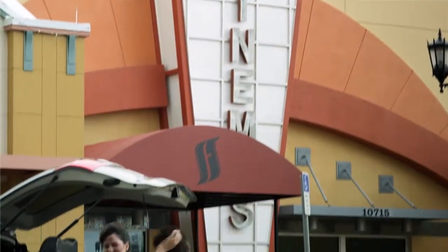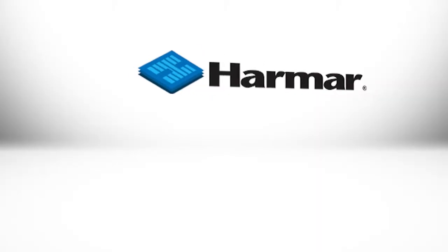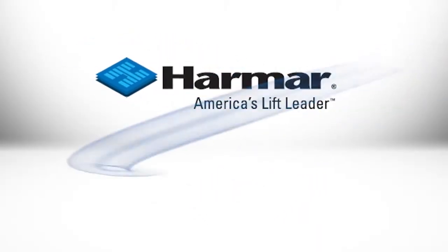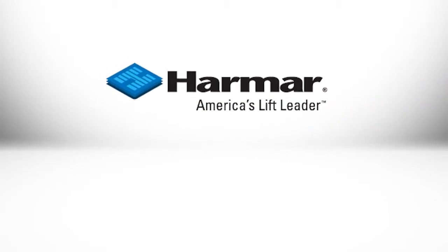Heading out is much easier with the right help. Watching a movie and enjoying a restaurant together is an everyday event with a Harmar Lift. Choose American-made Harmar for the lift you need.